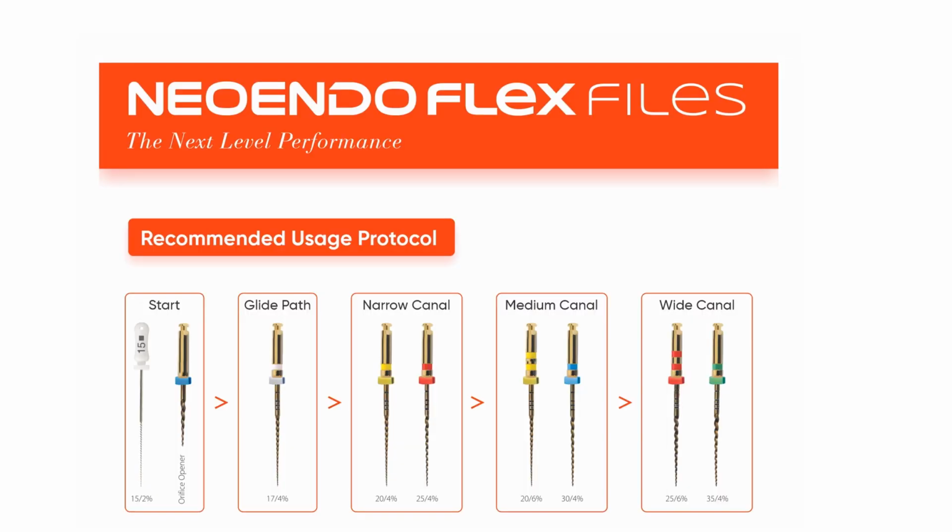So with the NeoEndo Flex files, first of all you have to start with your smaller number K files, and this is a rule that with every rotary file system you're using, you have to initially use your manual K files for making the glide path preparation. So always use your smaller K files, that means 6, 8, 10 and 15 K files for making the glide path. Only then you proceed with your rotary files.